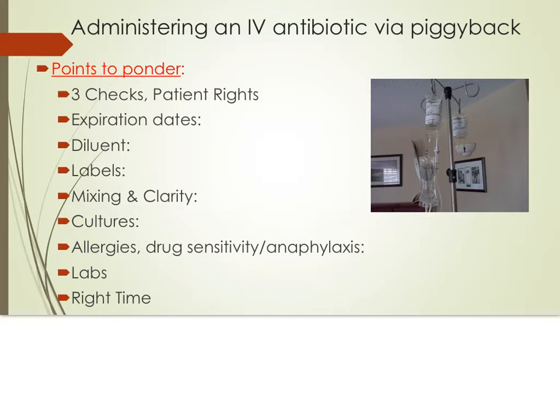Whether you are administering an antibiotic that you just prepared by reconstitution or administering antibiotic prepared by pharmacy, there are several important nursing considerations you need to implement. Check and recheck the order at least 3 times with the drug label, as you do for all other medications. Be sure to check the expiration dates of the medication, the diluent, and the IV solution.